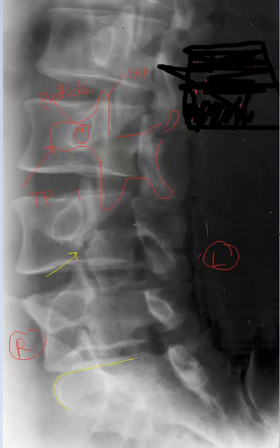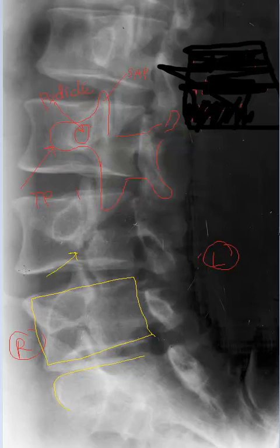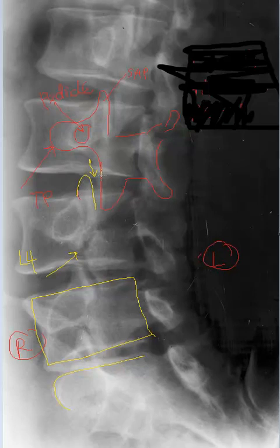Notice that this is the sacral base. Here's the L5 segment with its Scotty dog, and here is L4. This just represents the right side — we need to see the other oblique to determine if the contralateral pars inter articularis is also compromised. The facet joint is between the superior articular facet of one segment and the inferior articular facet of another, which is why we can see the facet joints very well on these views.